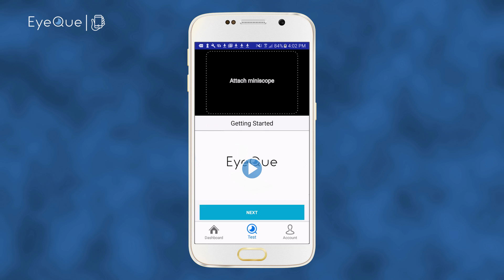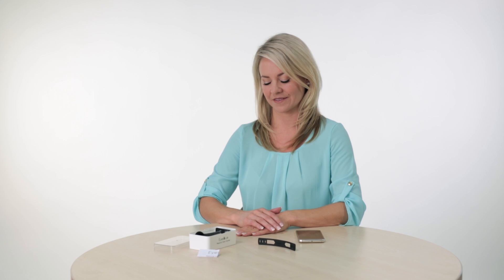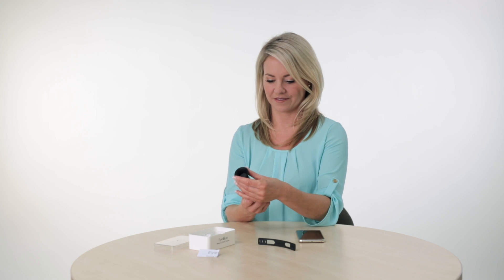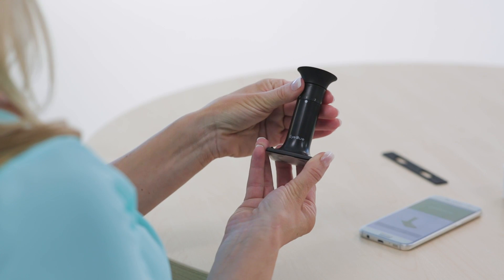To stop the video, just tap the screen where the video is playing. Otherwise, click Next. Remove the mini-scope from its case and rotate the eyepiece clockwise several times to get a feel for the movement.